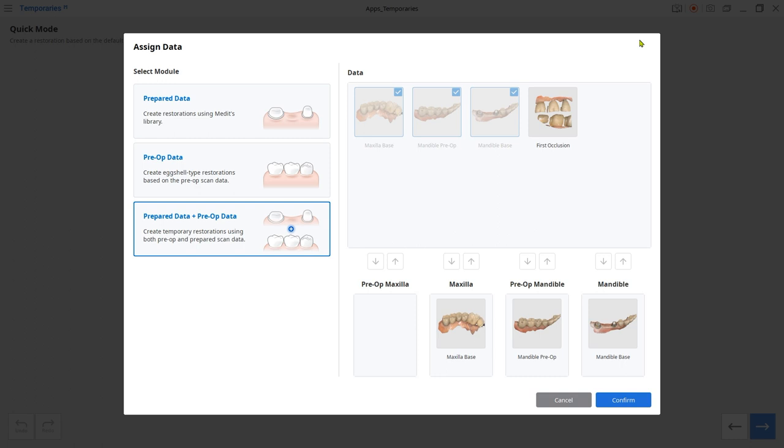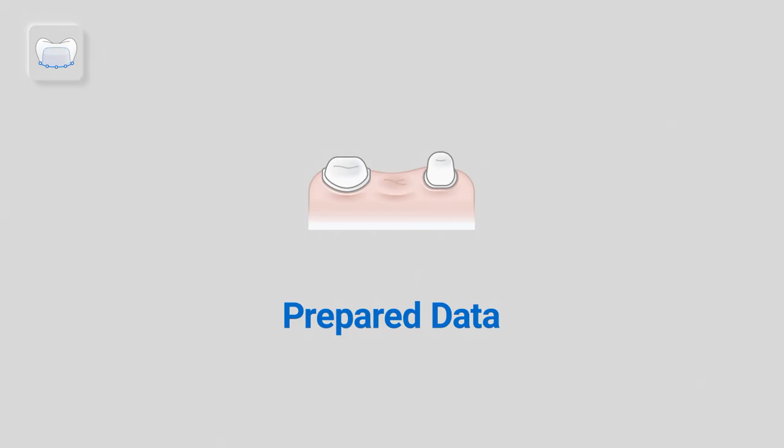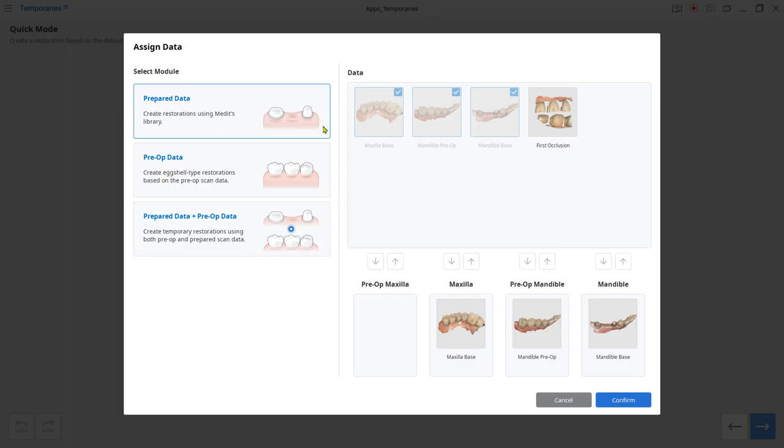Now, select the module from the left and the system will automatically assign your data. Choose prepared data module for margin drawing and use the library to create an anatomic temporary crown over it.